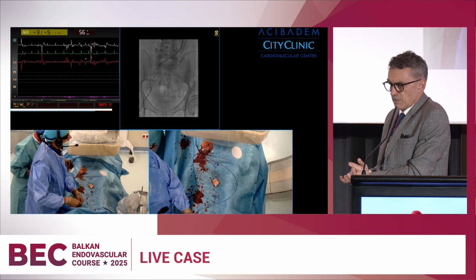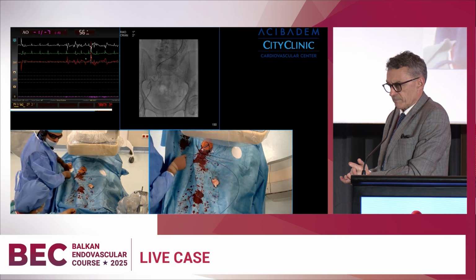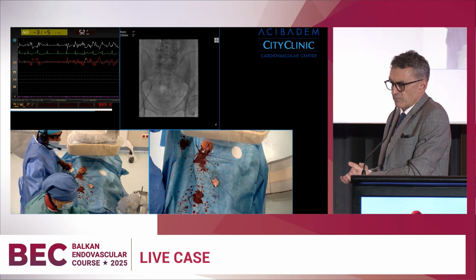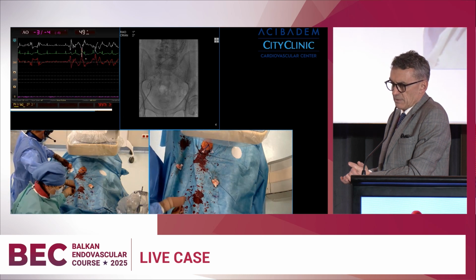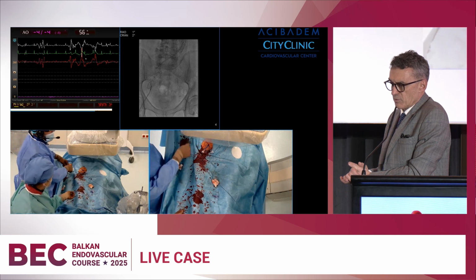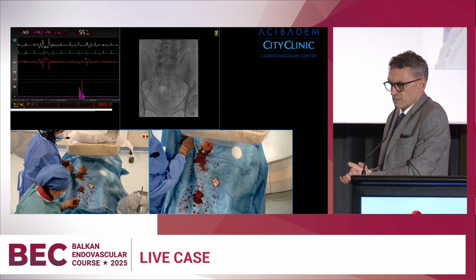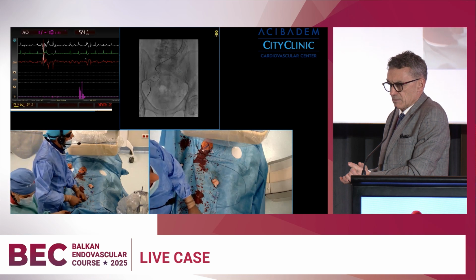Is it Terumo, the upper wire? I will take now the Advantage I have on the table. Yeah, it's the Terumo. I see, this is the tip of the catheter from above that is already inside the separated graft. This is excellent, and the Advantage will go down and hopefully will reach the lasso, the snare. Excellent.